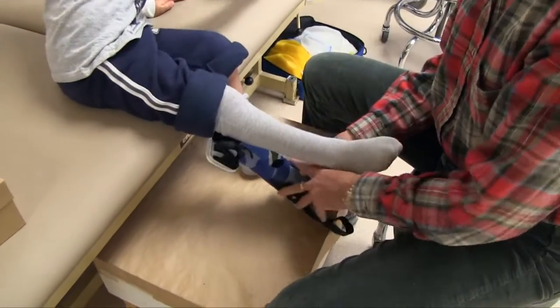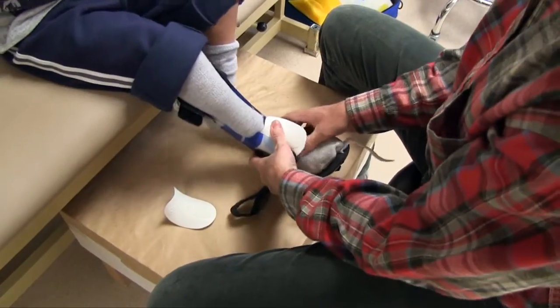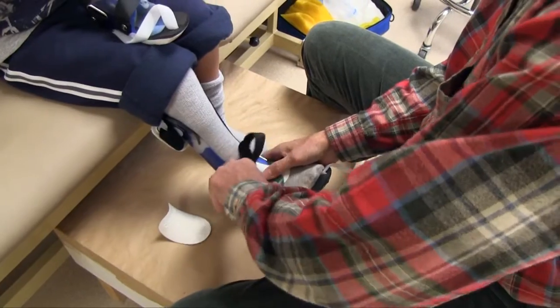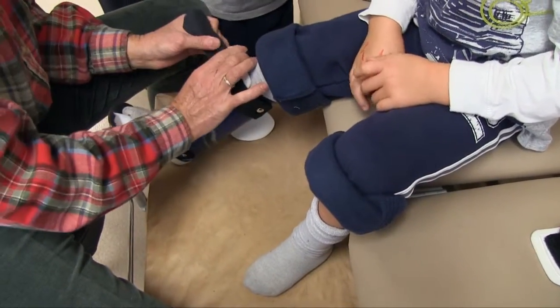We had decided to go ahead and cast him for bilateral DAFO FAs. He's had this brace previously and they've worked quite well for him. The FAs are a fixed ankle orthosis that will block the excessive dorsiflexion while preventing the semi-crouched posture.